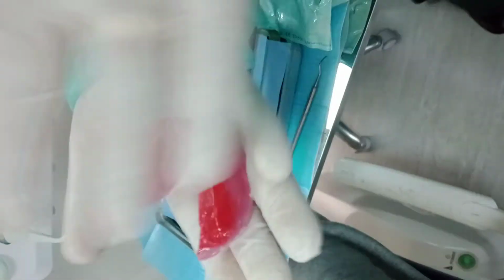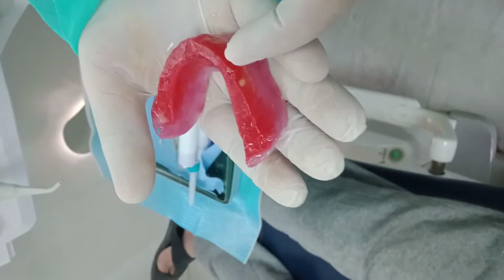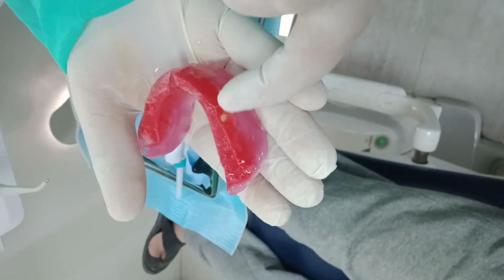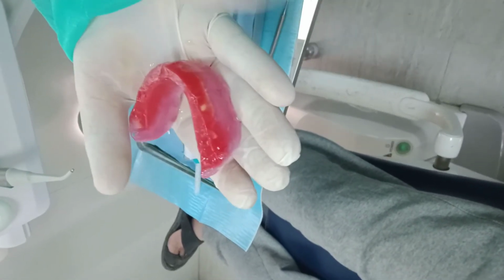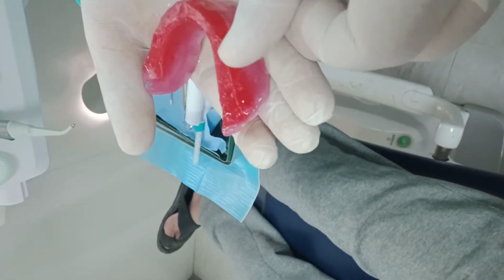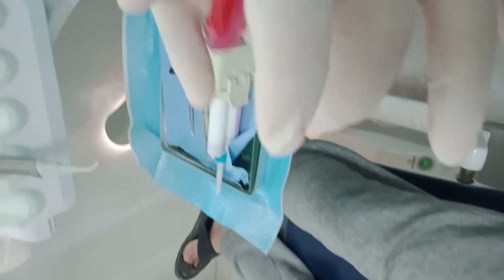But before doing all of that, recheck your RCP. Suppose use one of the teeth as a guide. Suppose this is the canine, upper canine. Put opposite to the canine tip a mark. Opposite to one of the molars a mark. Wherever you find a prominent cusp that you can see buccally, put a mark, and once you do the rubber bite, open and recheck the mark and see if the mark is still opposite to the same cusp, to verify that you're still in RCP.